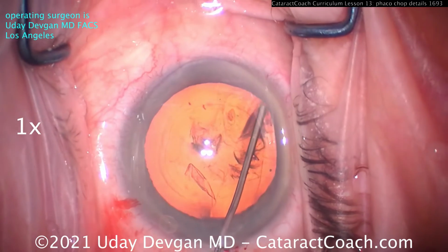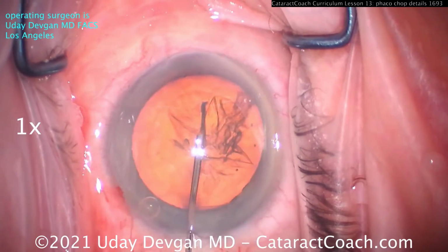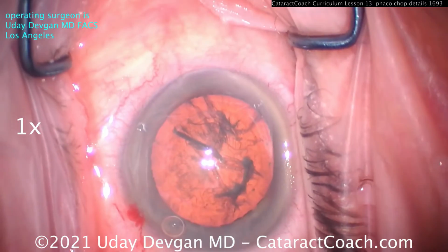So now we're going to do hydrodissection. Now watch carefully. There's a fluid wave going around the backside of the nucleus, another wave tapping the center a little bit more. And let's see, can we spin the nucleus? Yes, it spins. You remember, if it does not spin, you will not win.